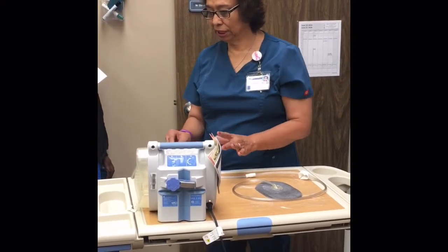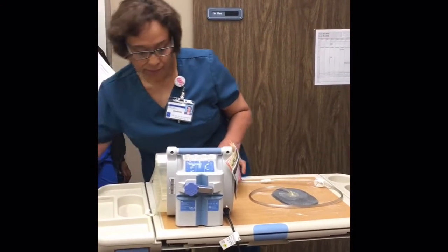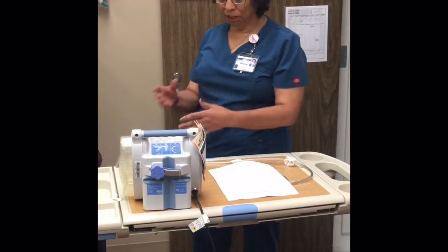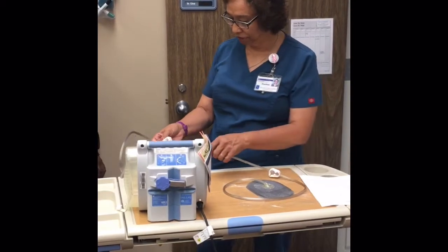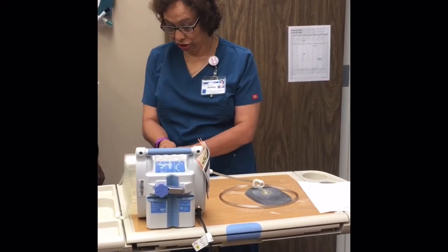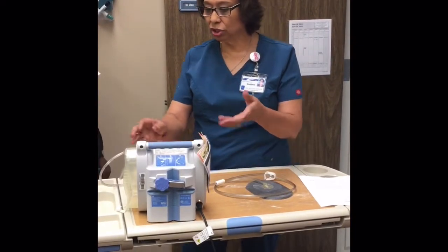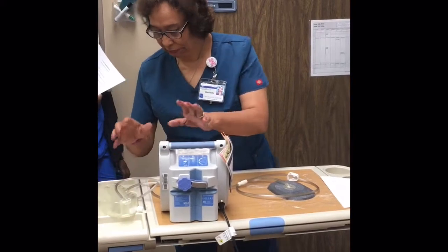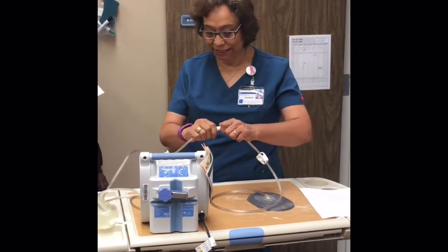When your unit starts to alarm, you want to come in, turn it off, okay? Because it's going to be a process of elimination. You're going to turn it off. You're going to clamp off the hose that's closest to the canister, or that's connected to the canister, and then you're going to remove the canister, okay? Sometimes it's just a faulty canister, it's not sitting well. You can try that, and then disconnect.